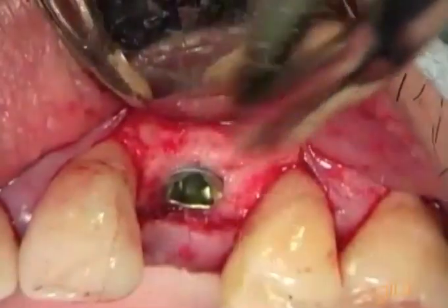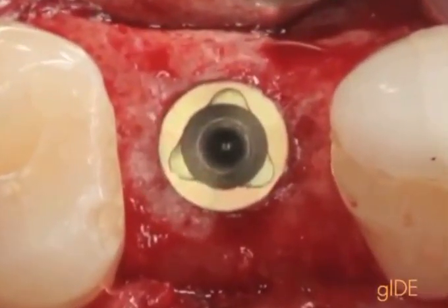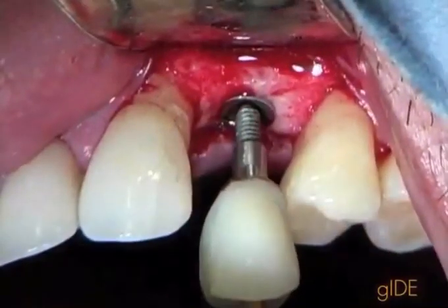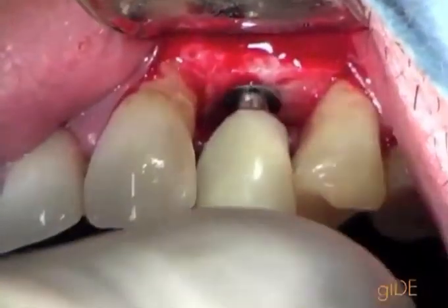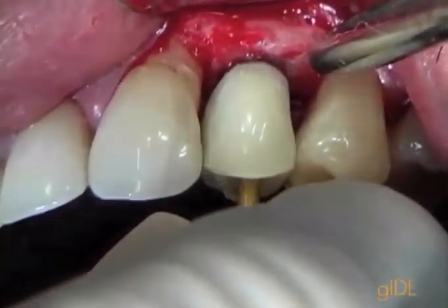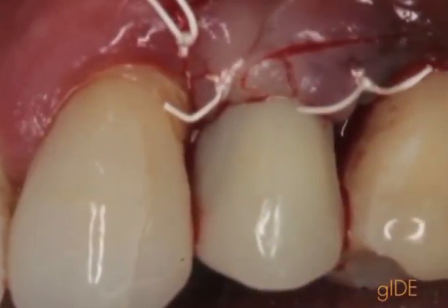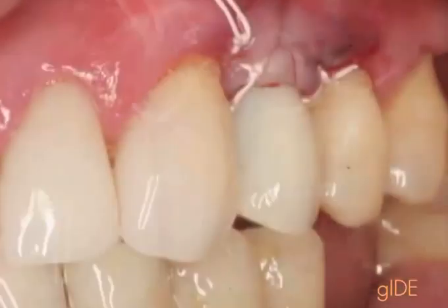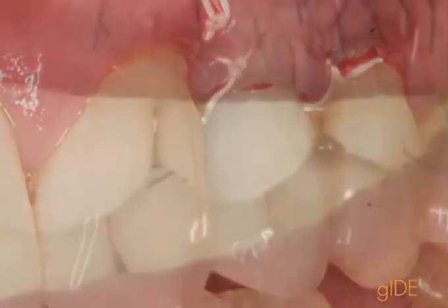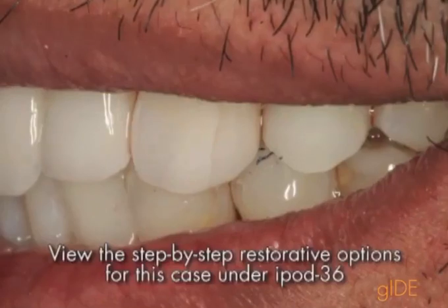The implant is positioned at or slightly above the crest of bone. And here's showing the internal lobe of this 4.3 by 13 facing towards the buccal, surrounded by excellent bone. A radiograph is taken to evaluate the proper placement.